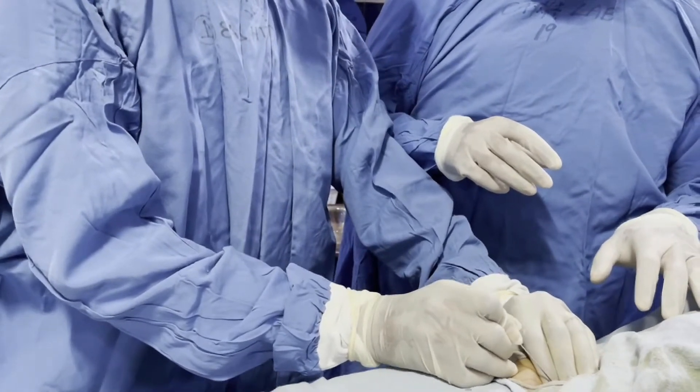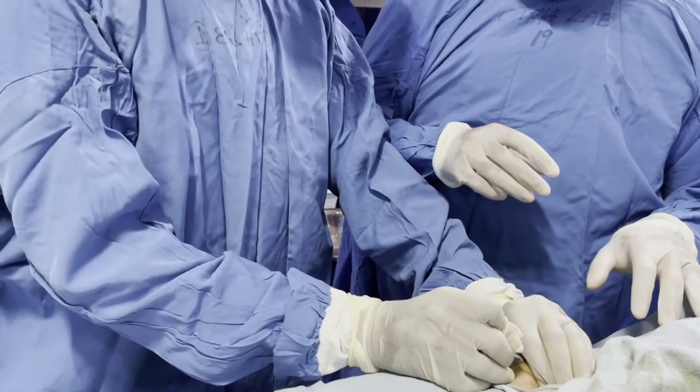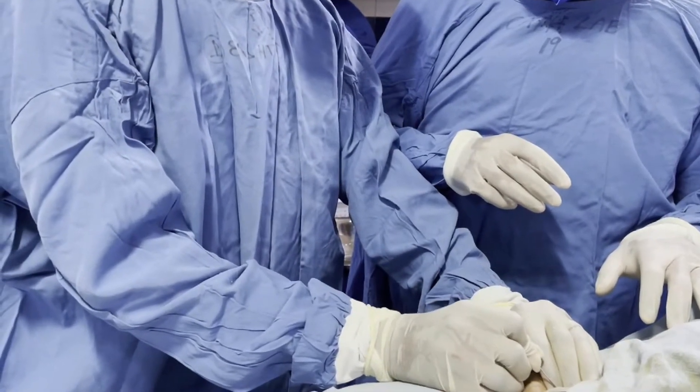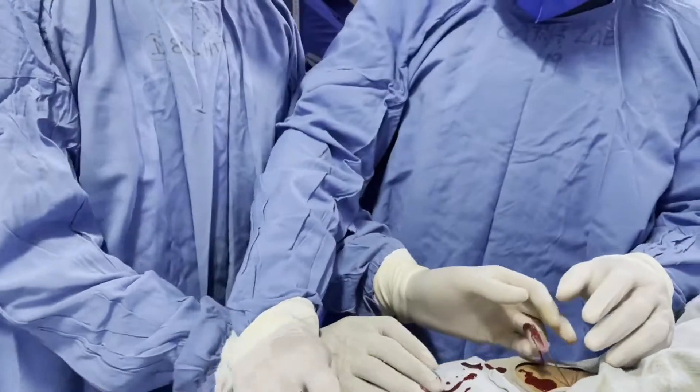The needle used here is the femoral artery puncture needle, also called the Seldinger needle. The gauge size can vary — we use the 18 gauge.